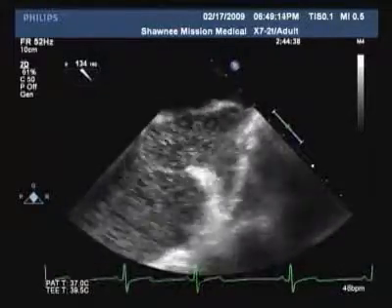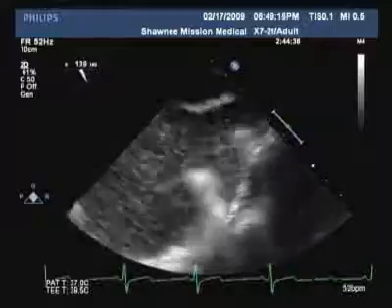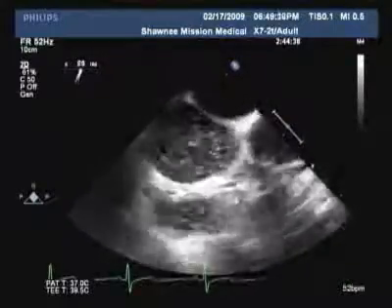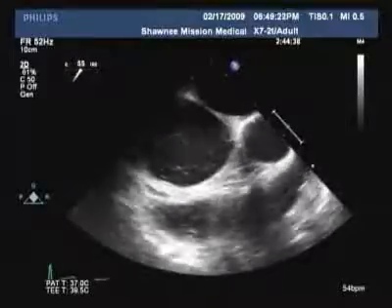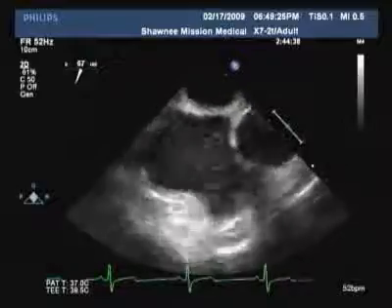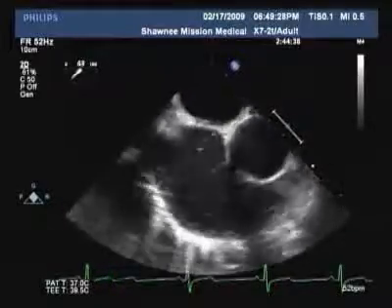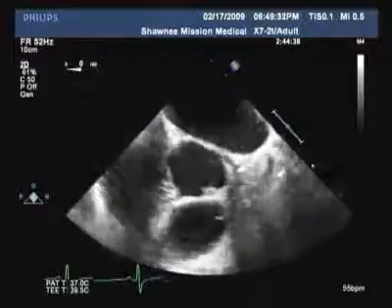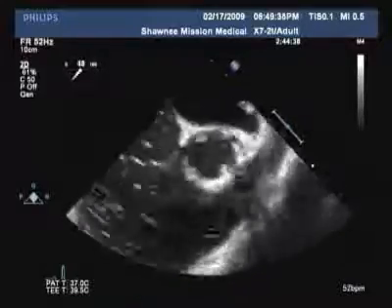It's a great study, and there is no evidence of anything going across there at all. It really outlines all the structures, and you can see that where the bubbles are is where the blood is. So you can just picture in your mind now where the blood is flowing through. It's flowing through where those bubbles are. The bubbles are mixed in with the blood. So the dark areas in these echoes are actually areas filled with blood, the inside of the heart chambers.